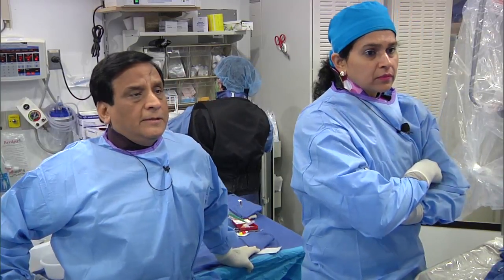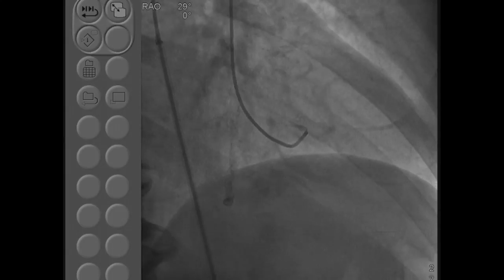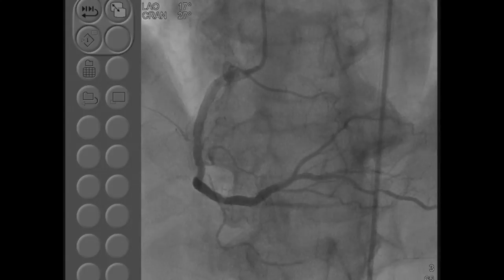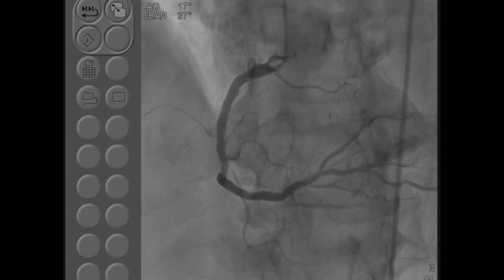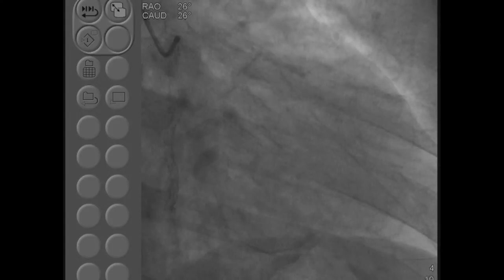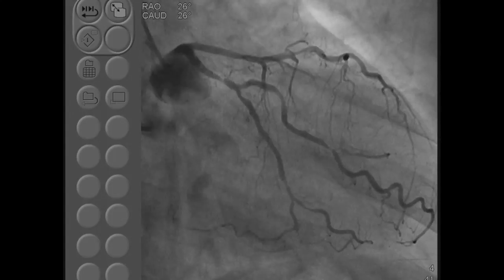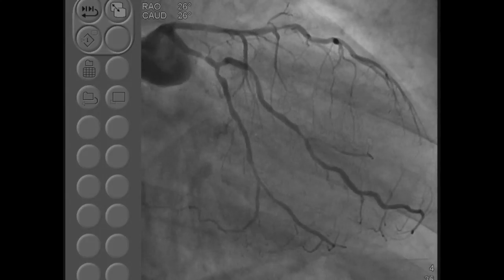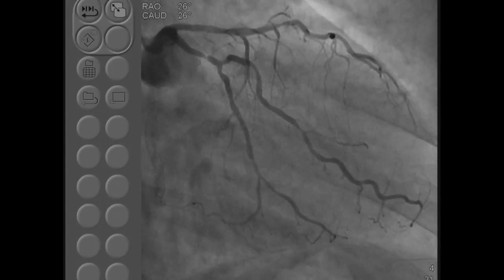With that note, Anu is ready to show the case, and then we'll come back to these points. If you see the angiogram, his LV function was normal, EDP about 10 today. The right coronary required rotational atherectomy and 2 stents, distal RCA from mid RCA almost extending to the proximal. The stent looks good, and this is his left system. Left main is okay, but in the circ we see a proximal 80-90% lesion extending to the distal, which is about moderate 50-60%, and the bifurcation is proximal circ going to the distal circ and involving OM1, which will be Medina 111.